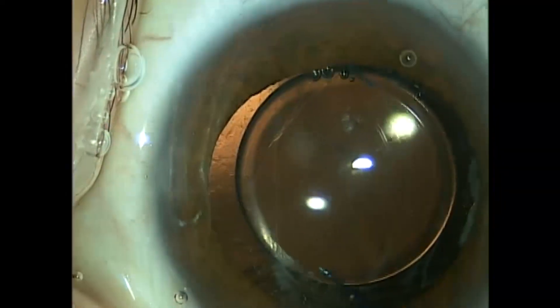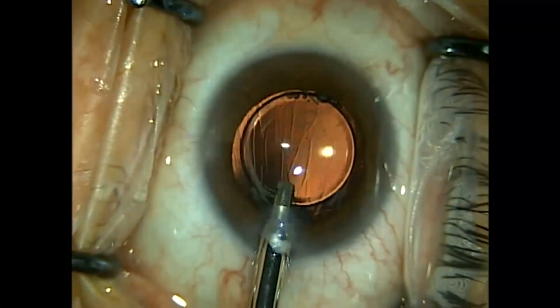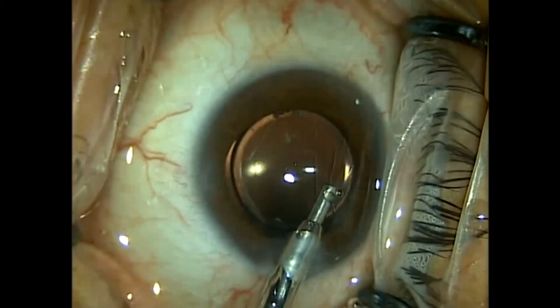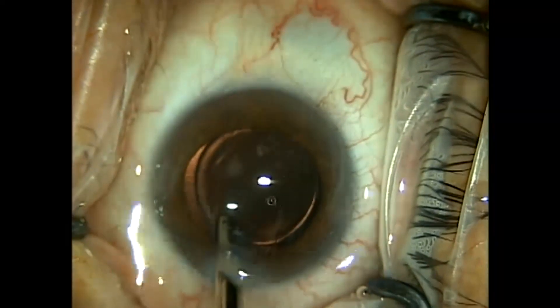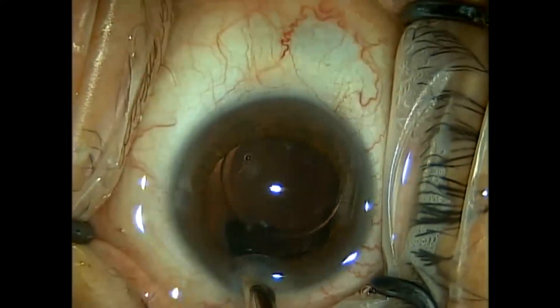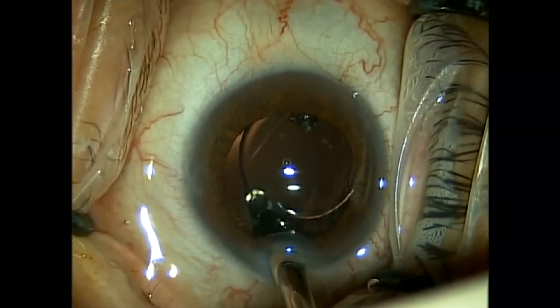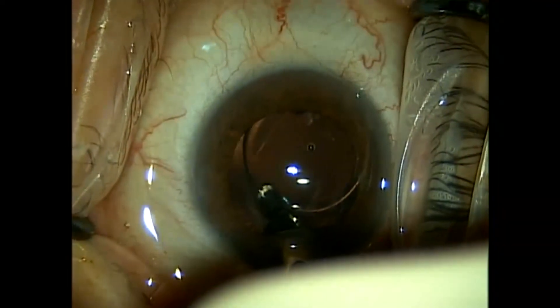I then proceed to do an anterior vitrectomy. I know there's quite a bit of viscoelastic in the eye, so not only do I remove the vitreous and viscoelastic in front of the IOL, I like to go just behind the IOL and pull the viscoelastic that's presenting itself into the anterior chamber back and remove it. At the same time, I'm taking out some of the asteroids, some of the vitreous, and a lot of the viscoelastic that was placed in the eye. Here I'm behind the IOL.